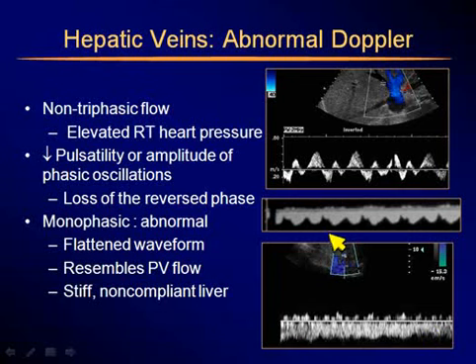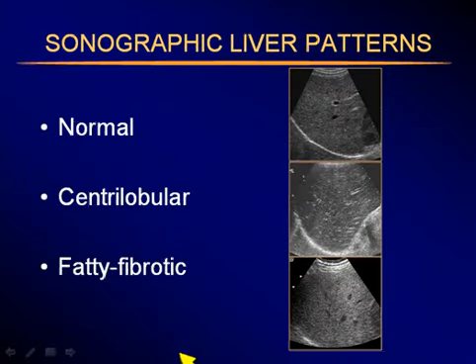It should be a nice pulsatile pattern, and all of a sudden now it's flat. It's because the liver is stiff, the liver is non-compliant, and does not allow this wave to be reflected in the vessels. So now let's talk about sonographic liver patterns.